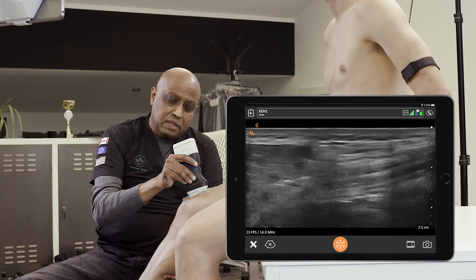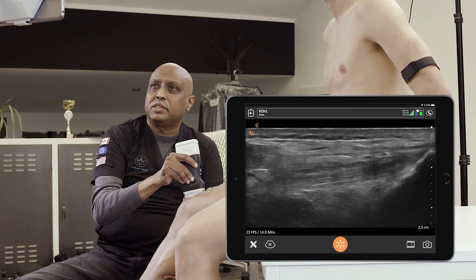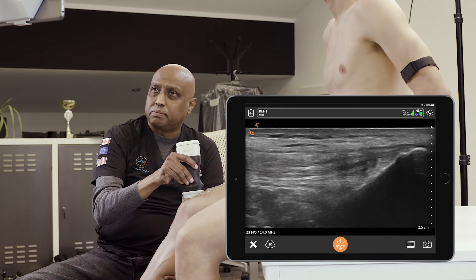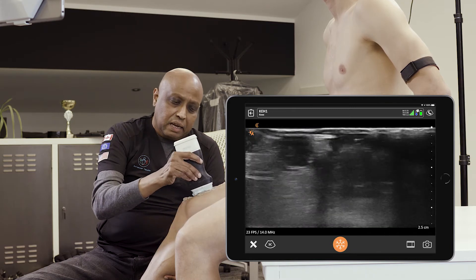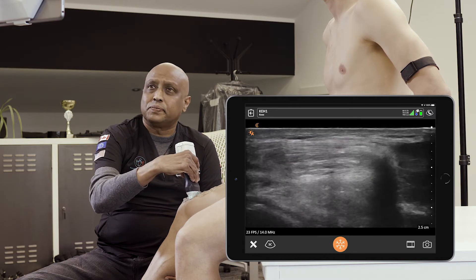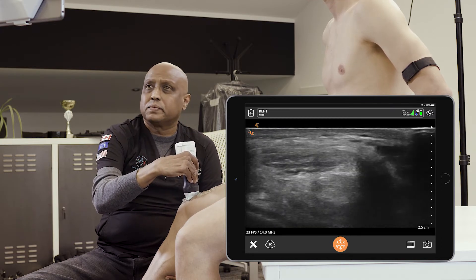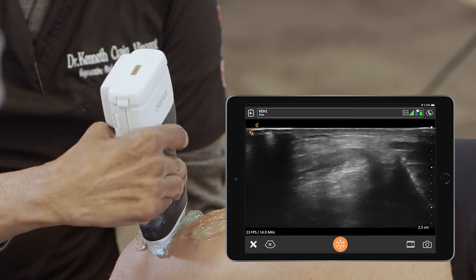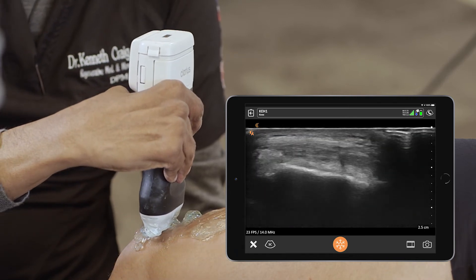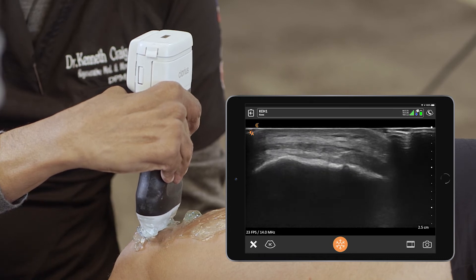I would like to pay attention to the insertion region because that's an area where pathology often presents itself. I would recommend a transverse scan here. Looking at the orientation, we can appreciate the apex of the patella.